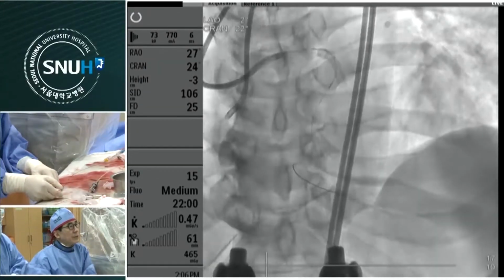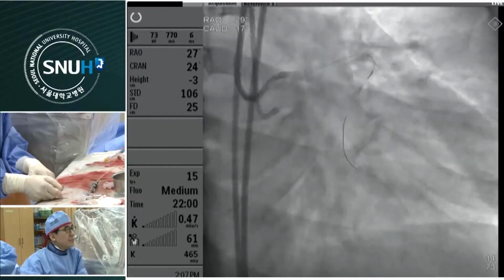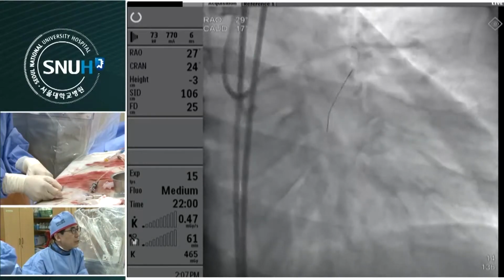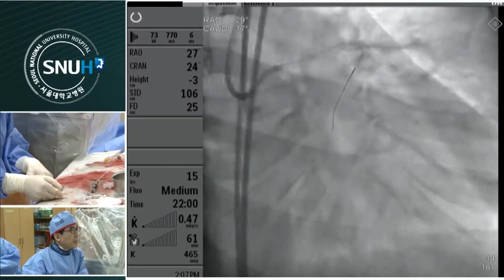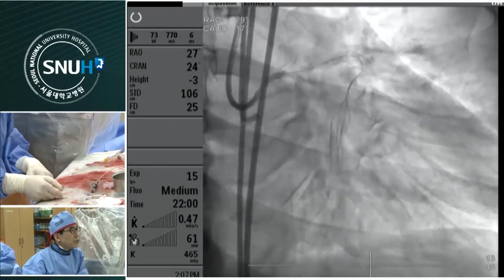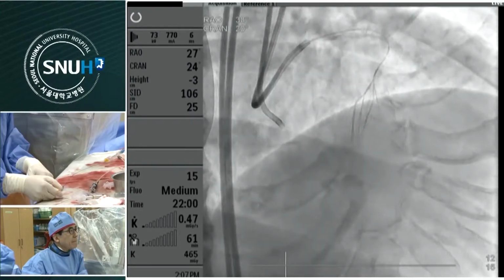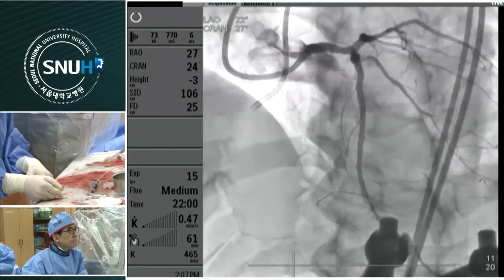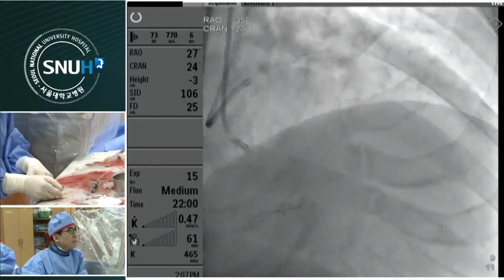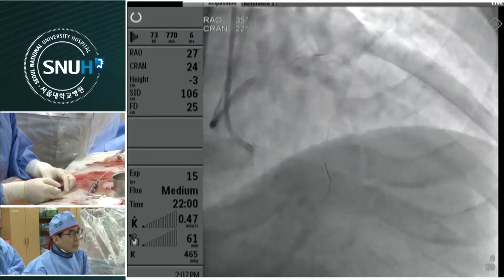Upon your recommendation, I changed the septal collateral branches from septal to the circumflex to PL branch. Let me check the branch from the other angle.